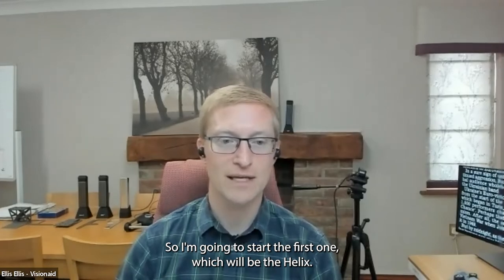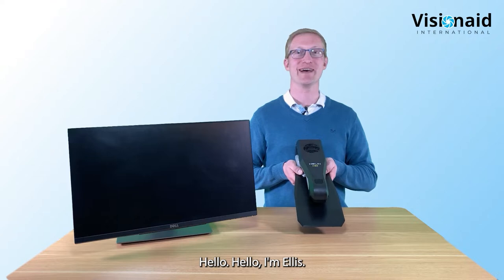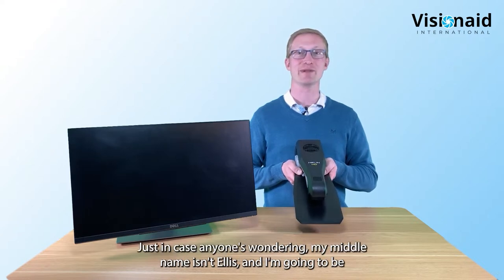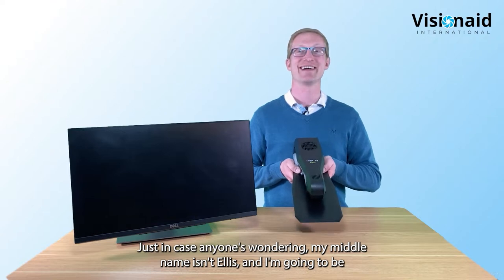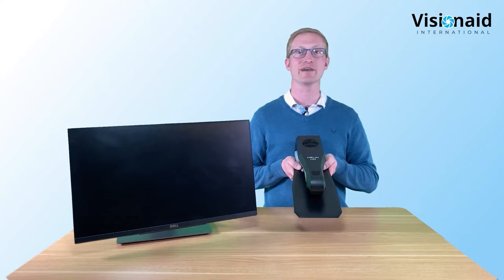I'm Ellis Ellis from Vision Aid International - just in case anyone's wondering, my middle name isn't Ellis - and I'm going to be taking you through our transportable video magnifier, the Helix HD.